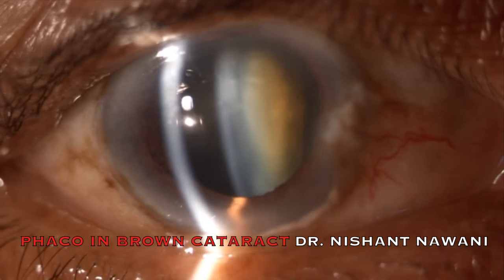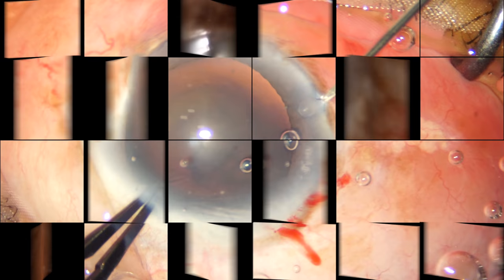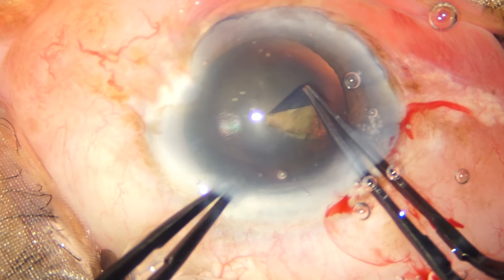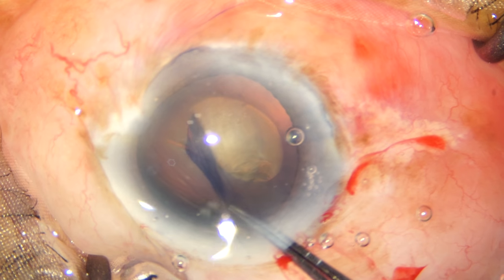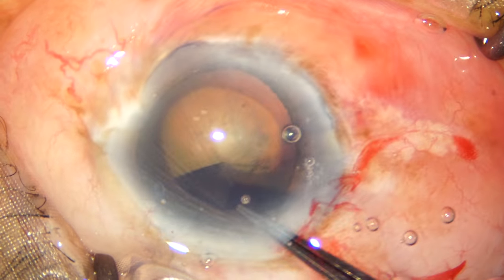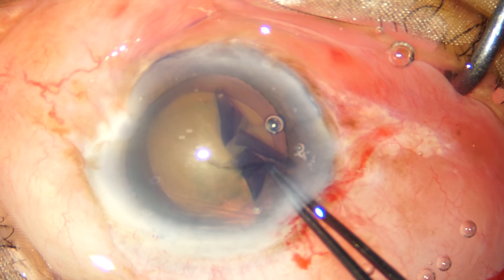Welcome back to the channel. Today's case is about phacoemulsification in a brown cataract. It is advisable to size our capsulorrhexis to about 6 millimeters whenever we are dealing with a hard brown cataract. This prevents stress from being transferred to the zonules and causing further complications when we're already dealing with a hard case.